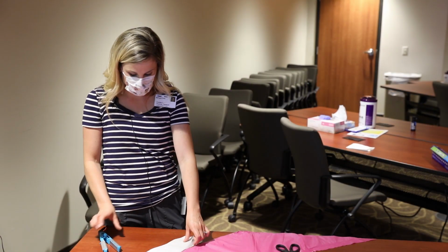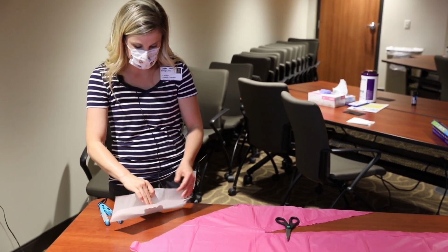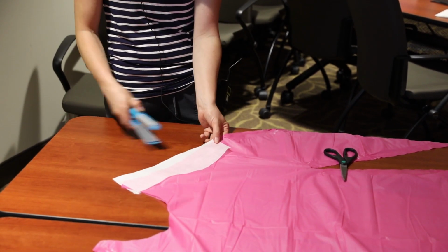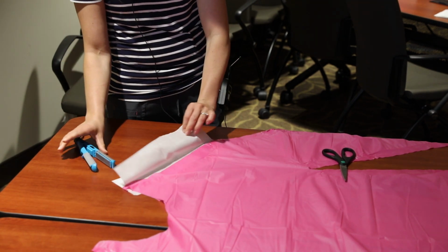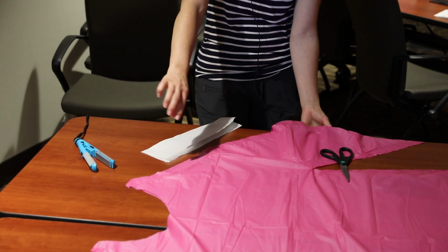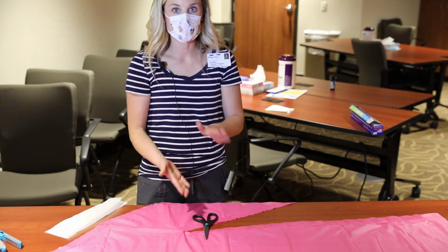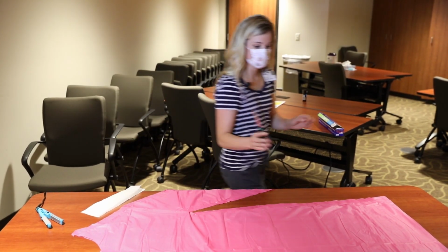In order to seal the edges together with a flat iron, you're going to take a piece of parchment paper and fold it in half and place the edges of your gown in there and simply just quickly run the flat iron through and move all the way down. So you'll seal the edges from here, here, down the sides, and do that on both.